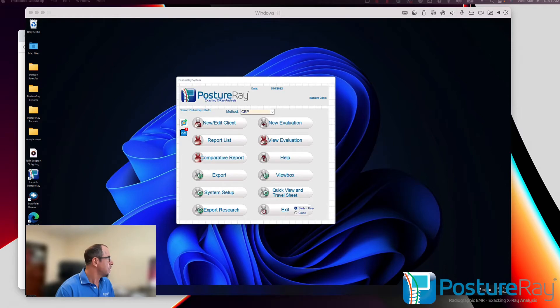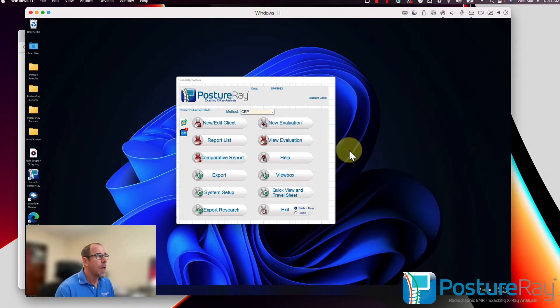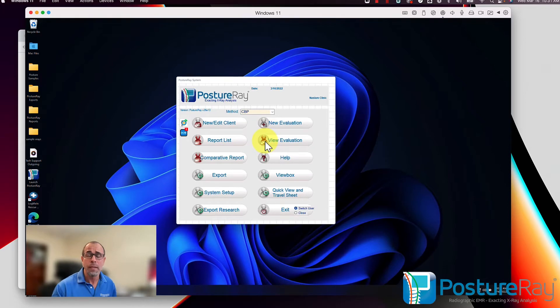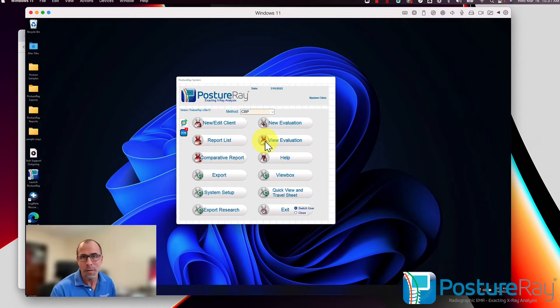Now we've added computer vision, and I'm going to show that when I switch over to the screen. So let me go ahead and show you some of the great features of PostureRay. I'm going to go into this screen right here — this is the main interface for PostureRay. I have already loaded up X-rays.